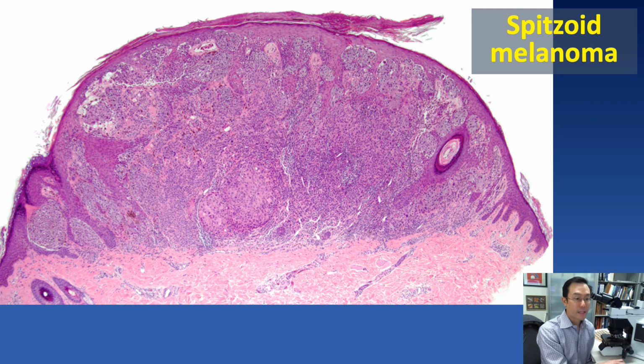And finally, we have melanoma exhibiting Spitz nevus-like features, or spitzoid melanoma. In this example, we can see a fairly symmetric and well-circumscribed tumor. It's got a nice flat bottom, high domed profile with epidermal hyperplasia, as would be typical of a Spitz nevus. This is from a child, but one can see in the central portion a disproportionately large nest here, a violation of the normal maturation that should apply to Spitz nevus.